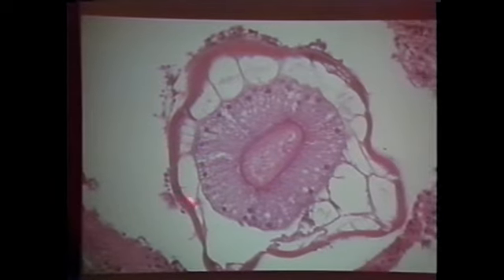Here, we have a lesion. I won't tell you where it is because you'll play the vet game. But let's look at this larva. What kind of musculature is this? Look at the demarcation between the red and the clear. It's flat. I mean, it's very smooth.